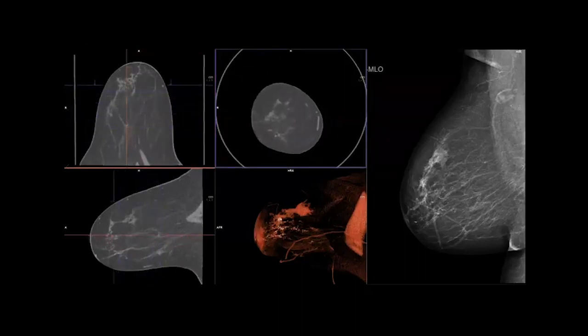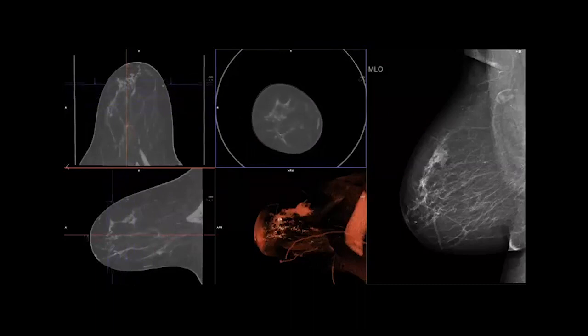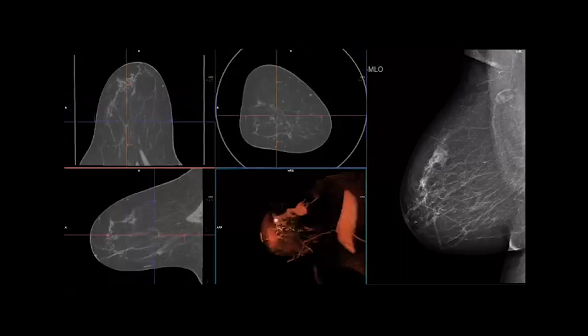By the way, the radiation dose you have to use for this MAMA CT is the same size as the plane FFDM. So same dosage, 12 seconds examination time.